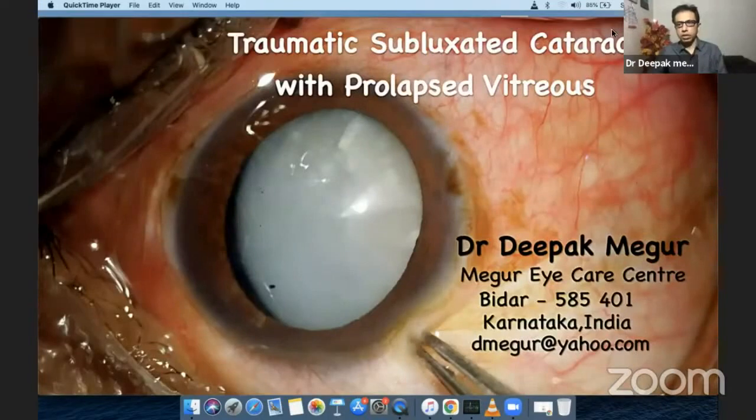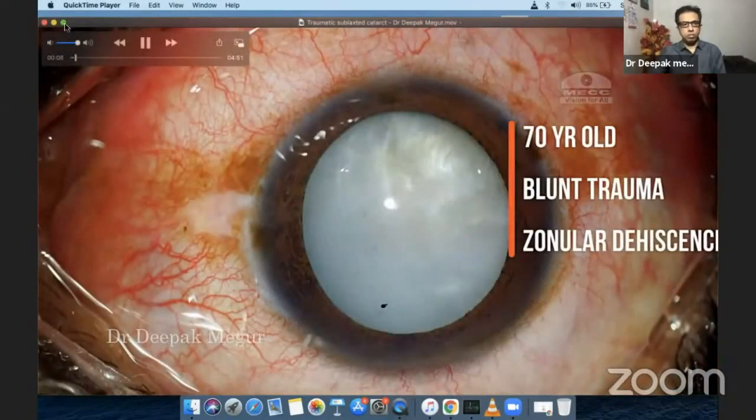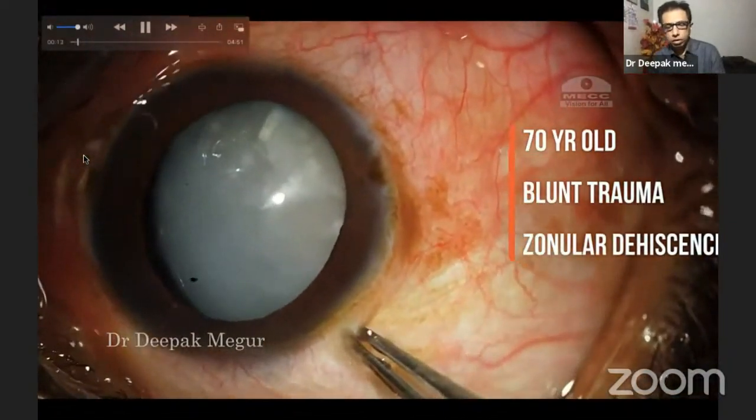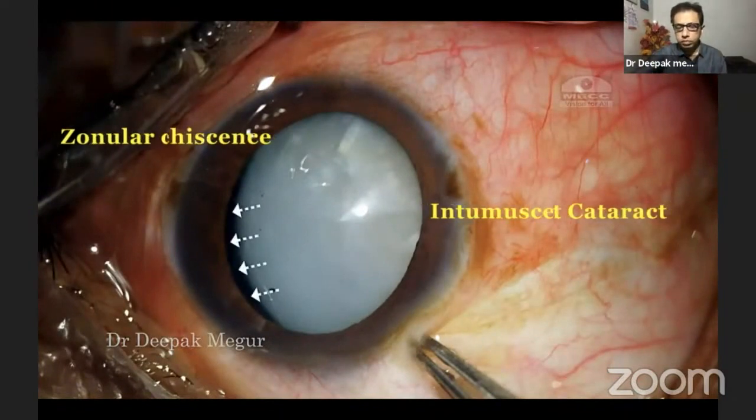Hi, I'm Dr. Deepak Meghur. Today I'll be sharing with you a case about a 70-year-old man who had sustained blunt trauma many years back. He now has an intumescent cataract with around 3 to 4 clock hours of zonular dehiscence.